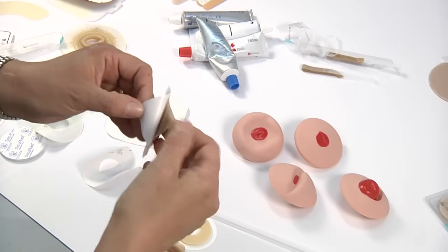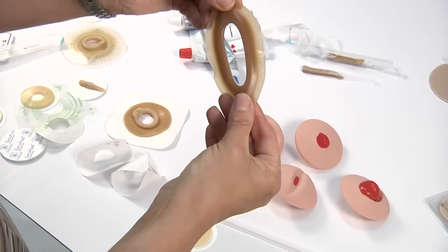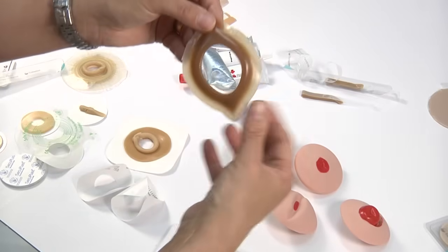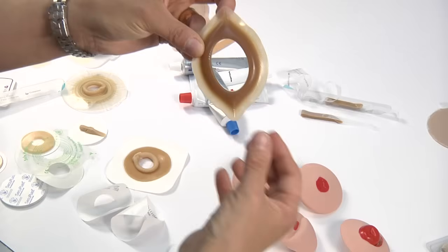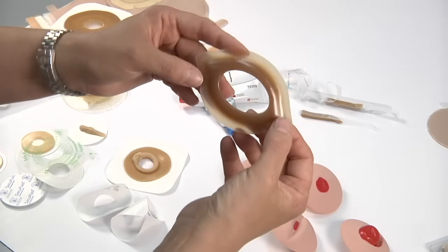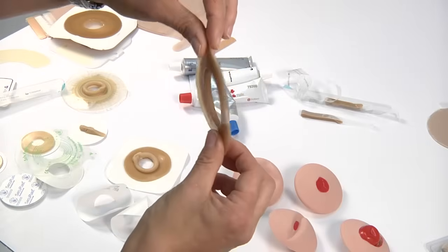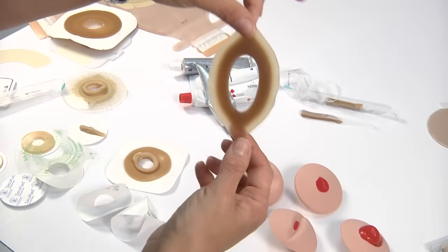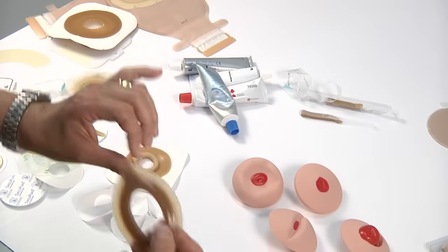These convex barrier rings now come in an oval shape. And again, the same idea is that you can distort it and stretch it out into various shapes, but you're going to see that it wants to go back into the shape that it originally came out of the package. It does have these little, I'm not sure if you can notice, these little tapered edges top and bottom. So these are actually quite good for individuals that have fistulas or heavily draining wounds and you're wanting to pouch that over top, and those little notches fit in there quite nicely.